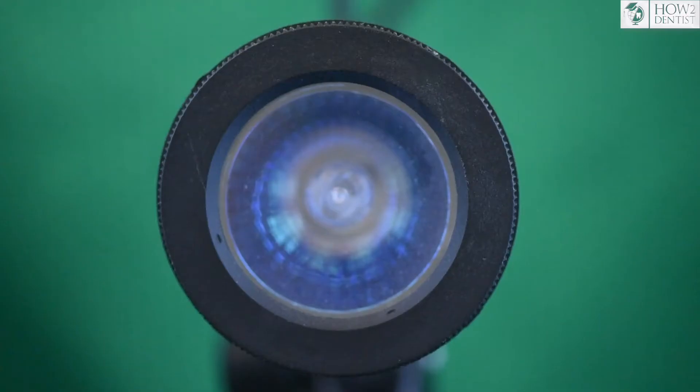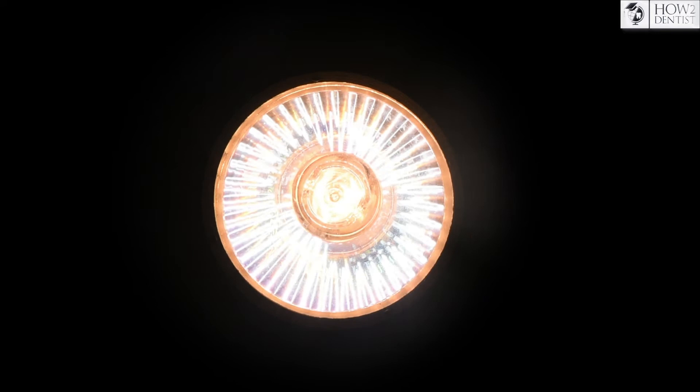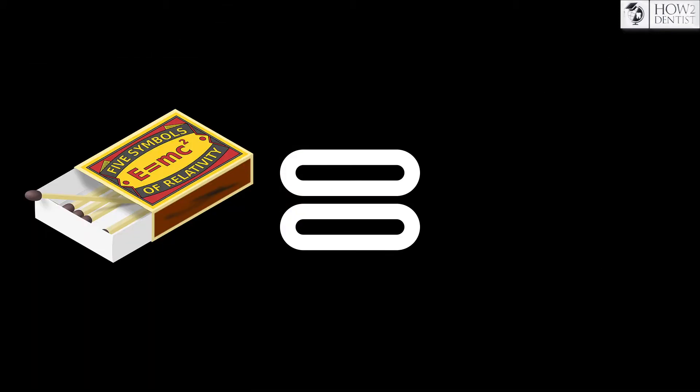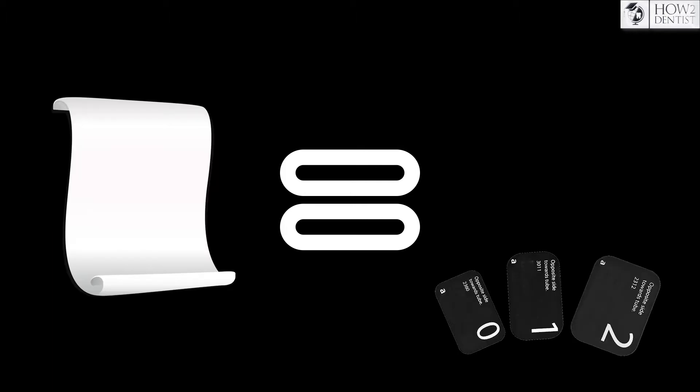As we've said, x-rays are actually light. For better understanding of x-ray geometry, we'll use a flashlight to imitate an x-ray tube, a regular matchbox to imitate a tooth, and a sheet of paper to serve as a film or visiograph sensor.